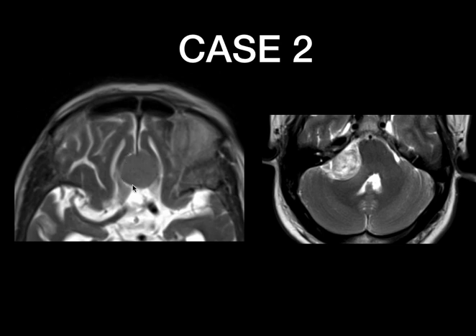You can see the CSF cleft between the cortex and the tumor, though it is not well appreciated in this section because of thicker slices. Thinner sections are needed for better delineation of extra-axial lesions. This is a classic case of a CP angle schwannoma — you can see the mass effect, the broad base along the dura, and a thin strip of CSF between the lesion and the cerebellar peduncle.